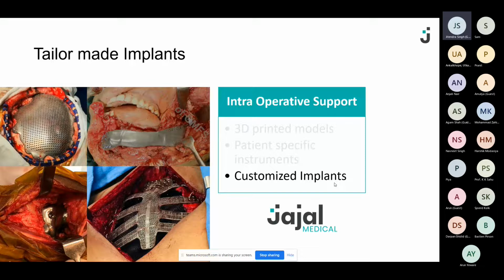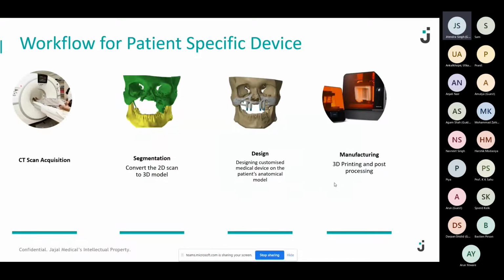Right from those kind of features to all the way, what kind of screw positions and other things could be optimized using those softwares can be incorporated into these customized implants. Now, we'll go back again to the workflow, much shorter, much simpler.